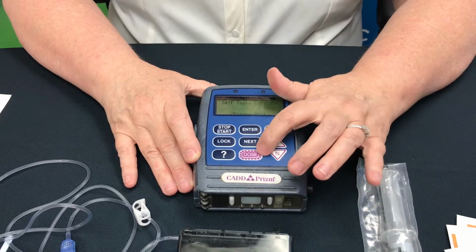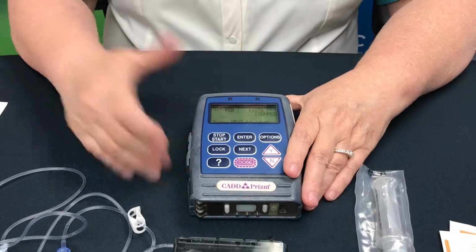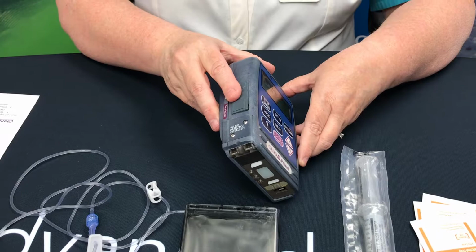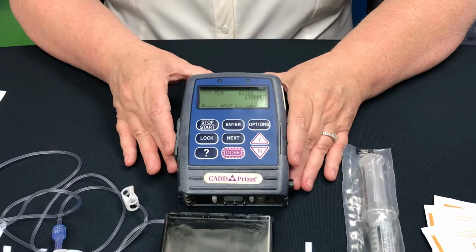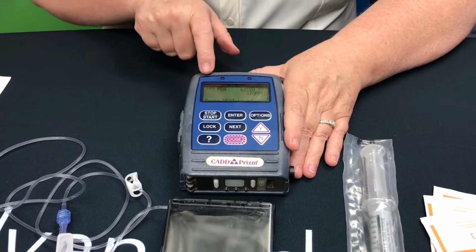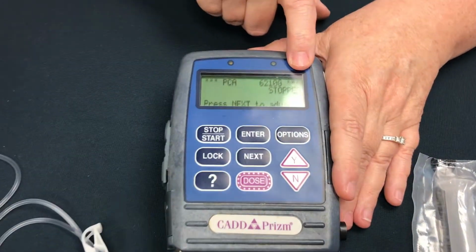Some patients just use the dose button here on the front of the pump. We also have a handheld dose cord that can be attached to the side of the pump, and you can use that just like the patient-controlled analgesia pumps in the hospital. Once the pump goes through its complete setup process, you notice that it's in PCA mode and currently it is stopped.